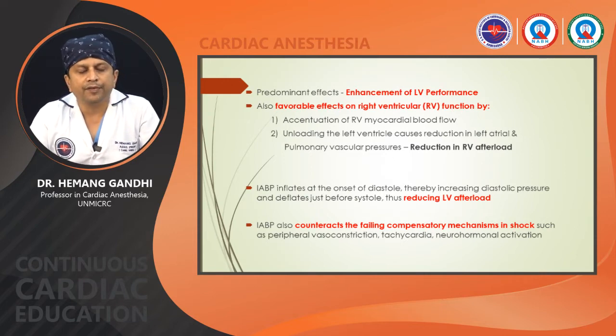It also has a favorable effect on right ventricular function by accentuation of right ventricular myocardial blood flow, as well as unloading of the left ventricle, which causes a reduction in left atrial pressure and pulmonary vascular pressure, thus reducing the right ventricular afterload. So by these two effects, it also helps right ventricular function.